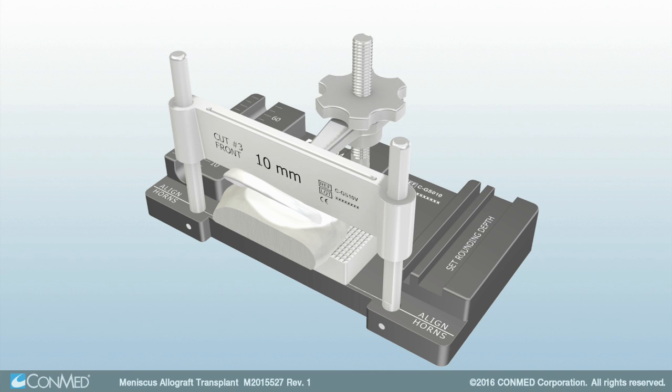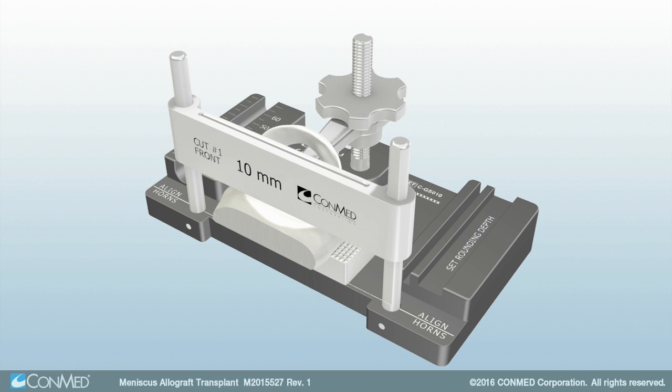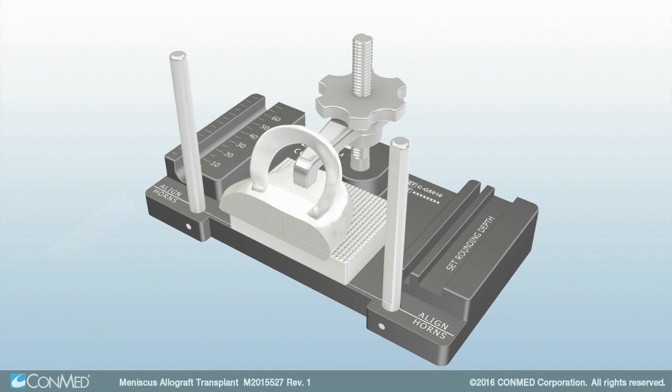Once alignment is confirmed, reposition the vertical fence so that the Cut No. 1 etching faces the front of the graft station. Perform the initial cut, cutting all the way through the bone block. Then remove the vertical fence.